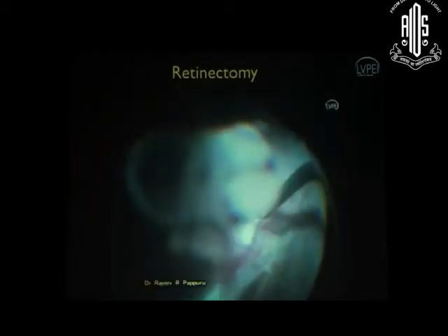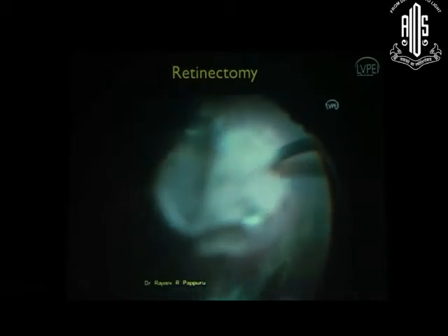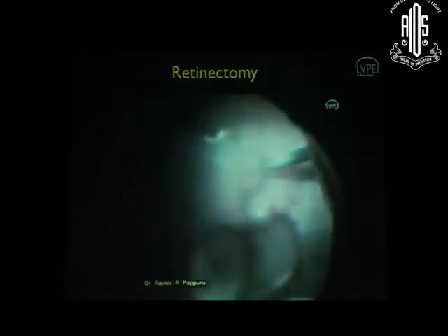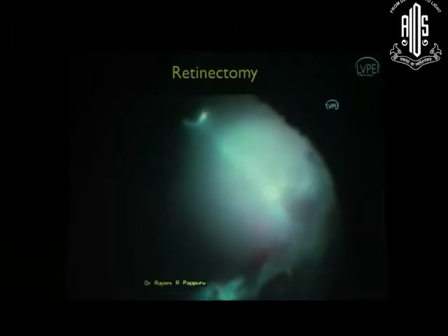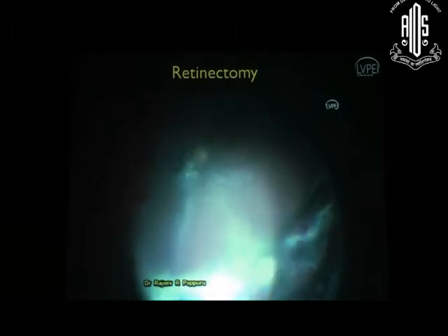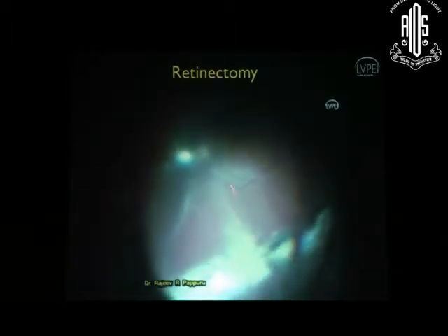So the next thing which I wanted to show is cutting of the retina. Nobody wants to cut the retina that easily, but sometimes you may have to. So look at this. You are removing all the membranes, whatever is there on the surface, and if you look at it, there is a fold sitting here. That's a retinal fold which is not going off.